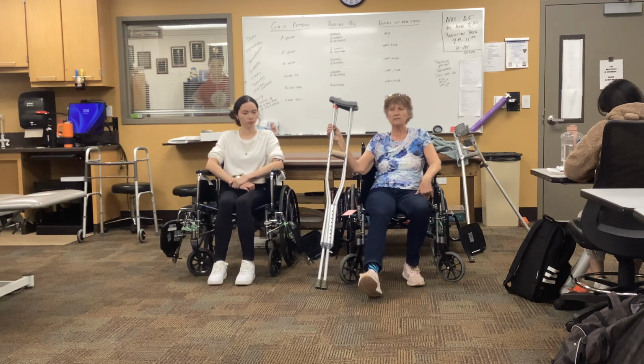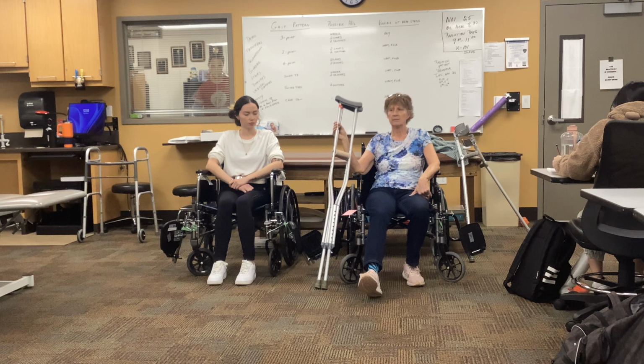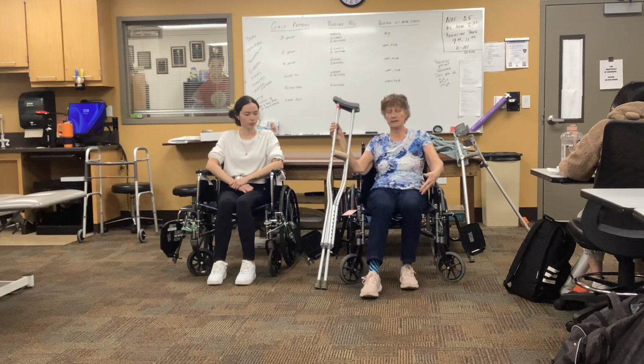Okay? And very often when somebody has these braces on and they're ambulating, the braces are in a locked extension position, because then this gives them the most stability. And these braces typically have the ability to be unlocked at the knee so they can sit, not like this, but with their knees bent in a normal sitting position.